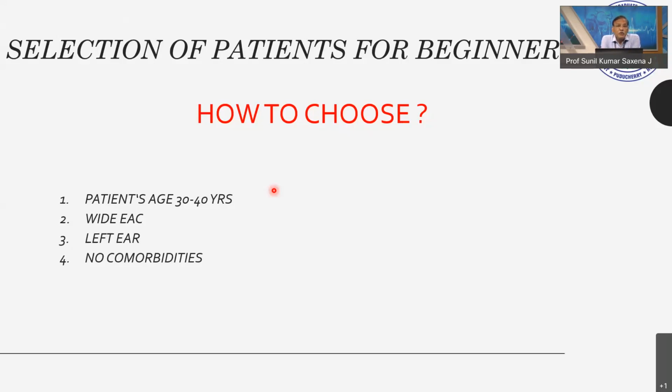You will be able to fix your endoscope. Your stability will increase. One. Second, you will be able to work with your instrument. Third, you won't touch the other areas, because the patient feels uncomfortable when you put the endoscope in the bony meatus or you hit the bony meatus. If you remain in the cartilaginous meatus, the patient will not be uncomfortable. And with changing the position, you can see all the areas; that will come with your experience.